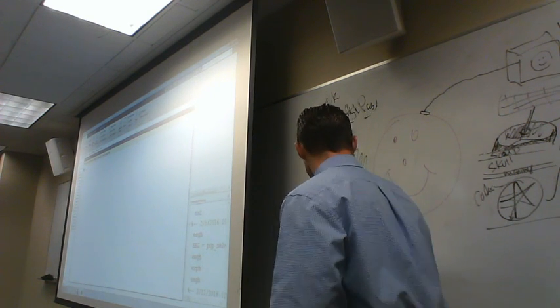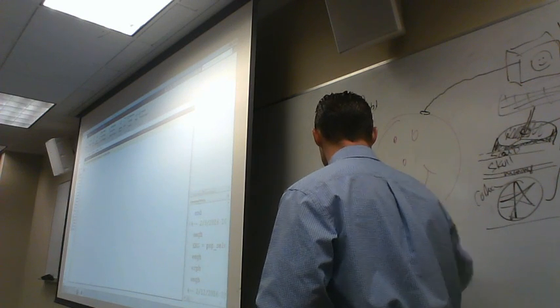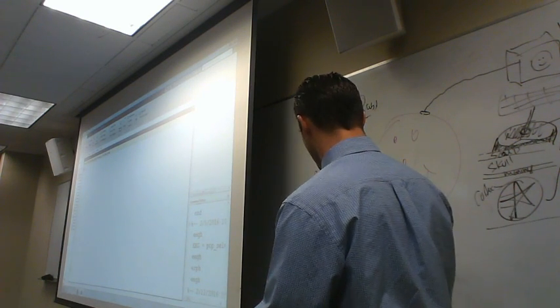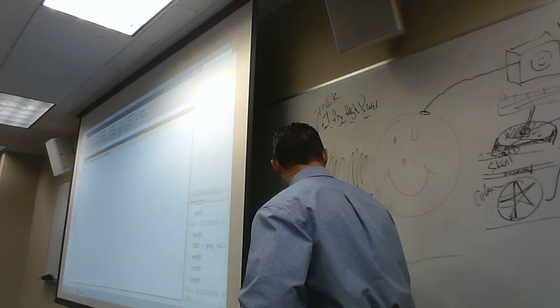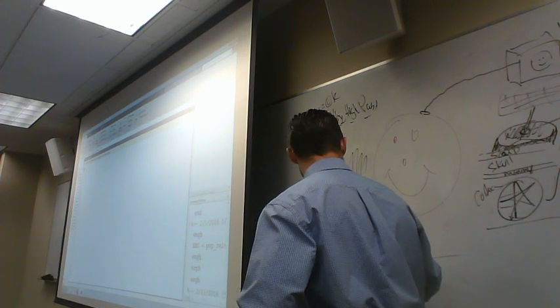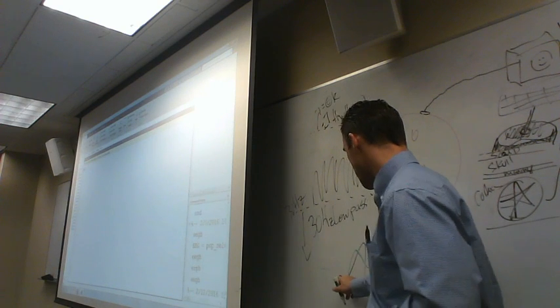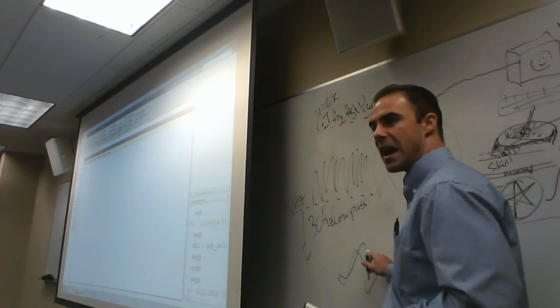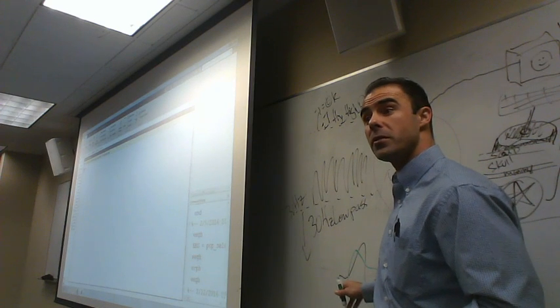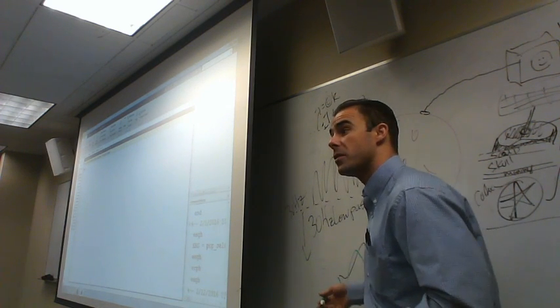So sometimes, depending on the type of filter you have, if this is your normal signal, it might change it so that after you filter it, it might come out like that. Now, it basically maintains the same general aspects, right? But it is still fundamentally changed. And that happens in every subject, and then you average all that together.